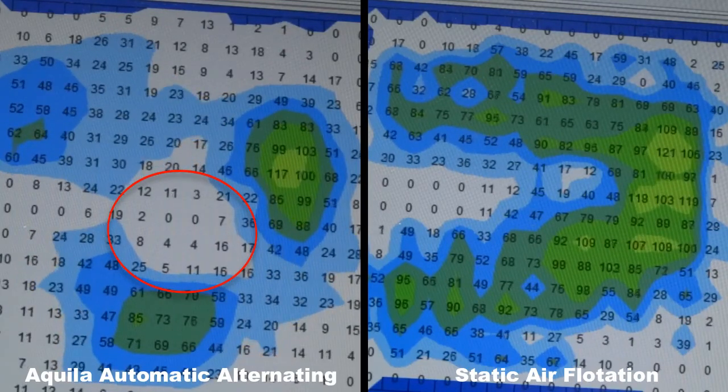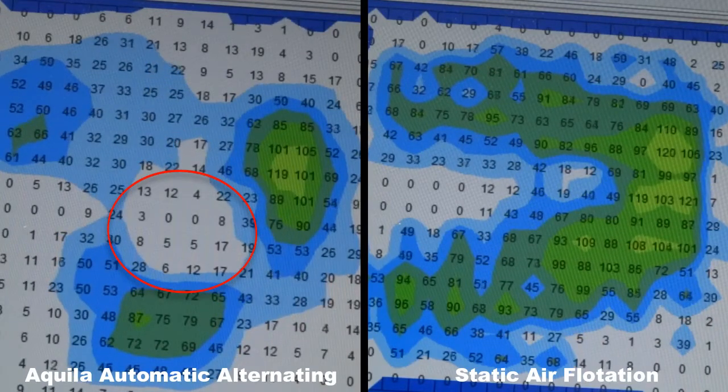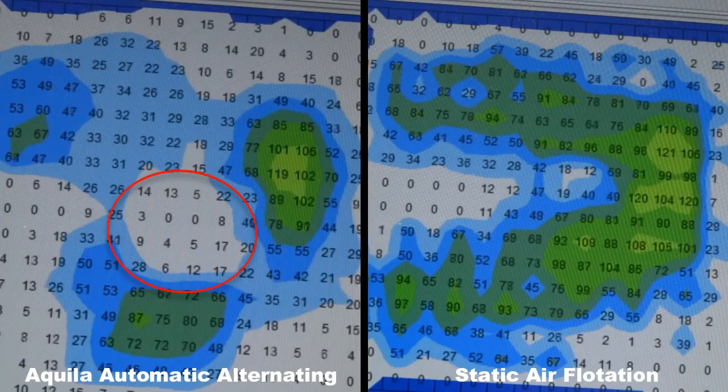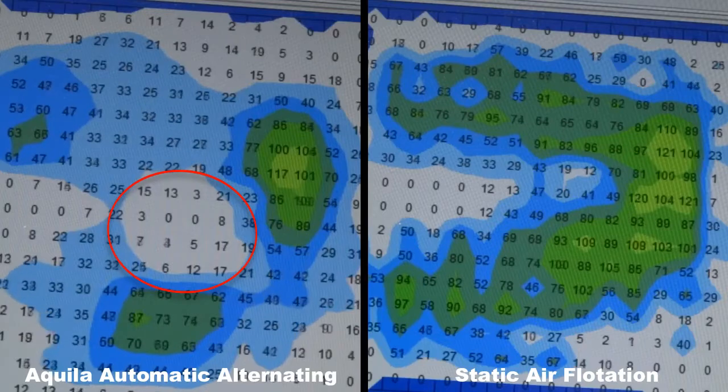On the right, a commonly used static air flotation cushion. The static cushion is motionless. To understand the differences, the Soft-Tack cushion is a dynamic cushion. This means the cushion creates movement on its own.